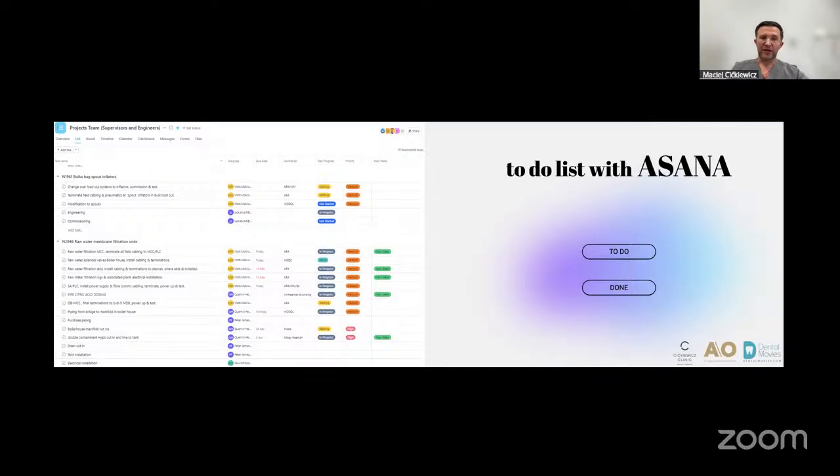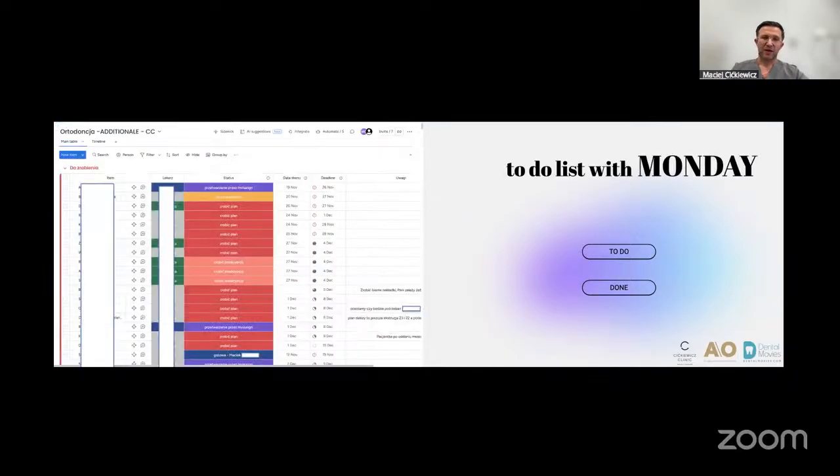Or you can bring like us. We created boards on Monday, and here you can see what we created. On the left, we have the table with the surnames and the names, and then we have the doctors here. And here we also have the updates, what we like to do. For example, we are going to do the plan, and then we are creating the new plan, or doing the new prescription, or going to the prosthodontic treatment for the patients, and then we schedule another scan.